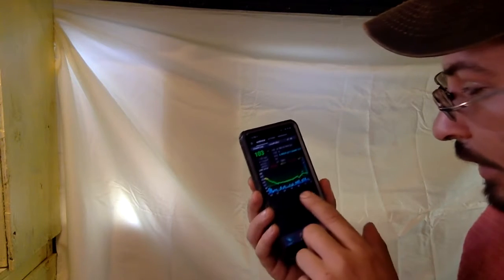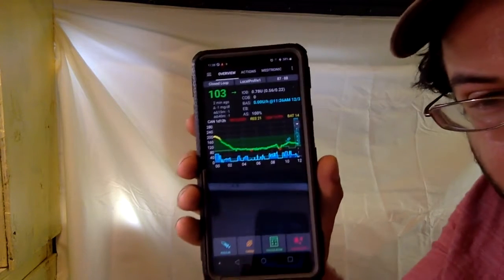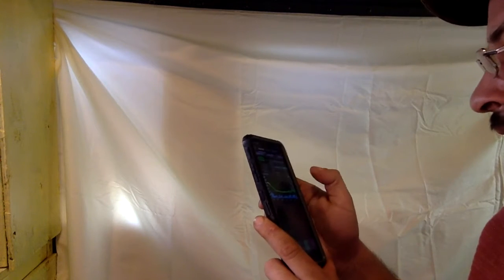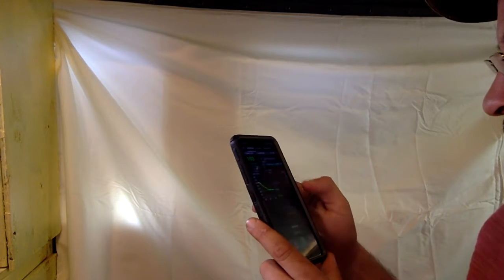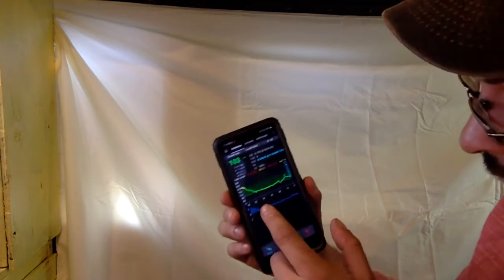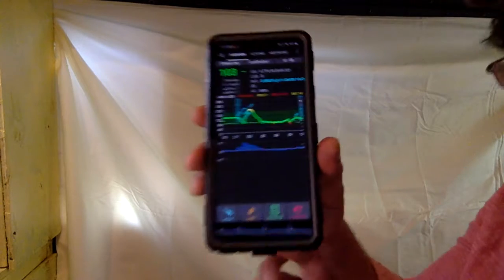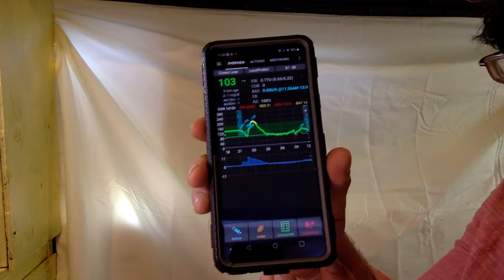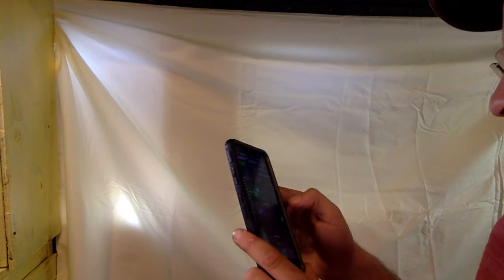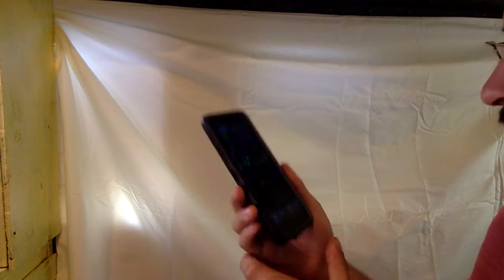Whereas during this time, after 7, around 8 o'clock, it was raising my basal. So I've got low basals, then, is that raised? I'm not sure if it's raised. Anyway, so that's the basal. When we go to insulin on board, you can see there again, it was about correct, but it went a little bit lower. Whereas before that time, it shot up really high with my meals. So it just had to go a little bit below the line there. So this, you just really want to get good at these. Carbs on board. I didn't enter any carbs for anything that I ate today. It's around noon, and I sort of skipped breakfast.